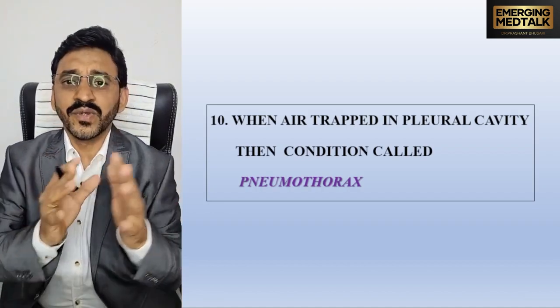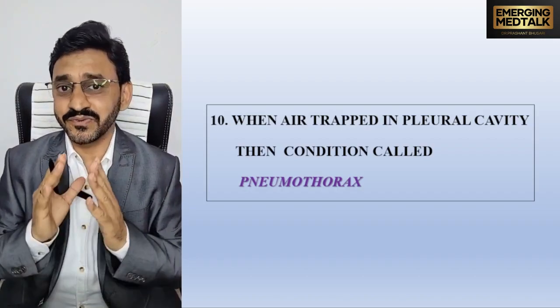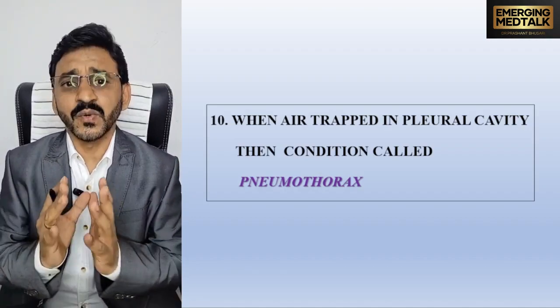So this is how we have discussed, very simply, the practical approach to the chest radiograph and reporting, and the very important crux. I think you liked it.